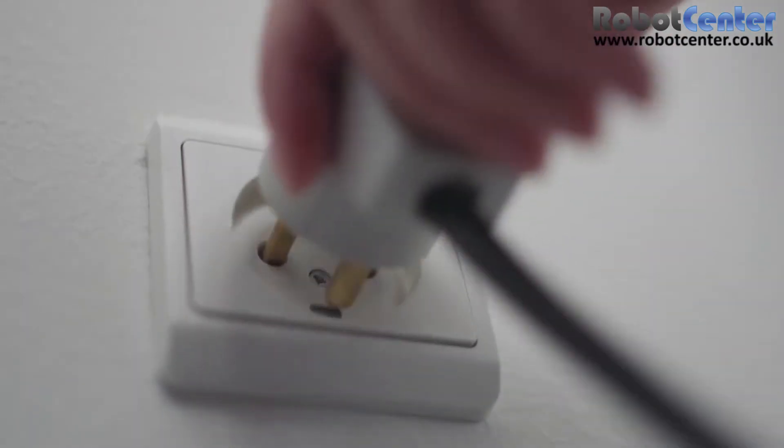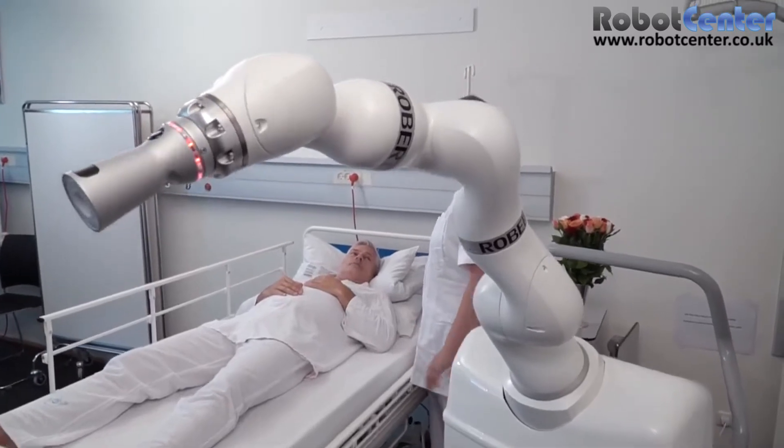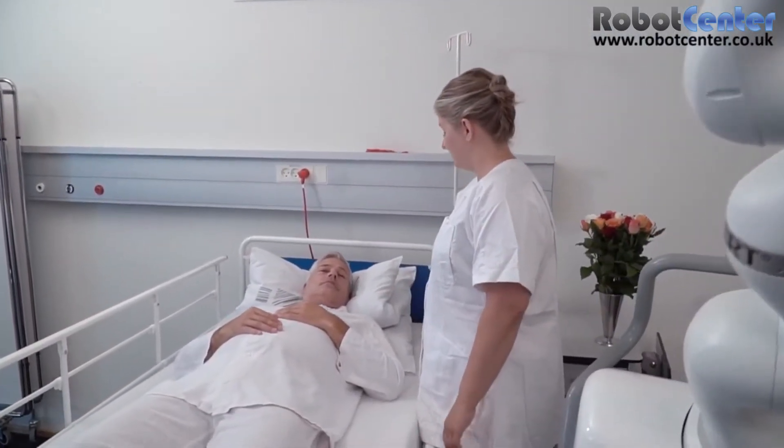Robert is very easy to start up — just plug it into an ordinary socket outlet. Robert will then perform a safety test, and thus neither patient nor therapist need worry about safety.